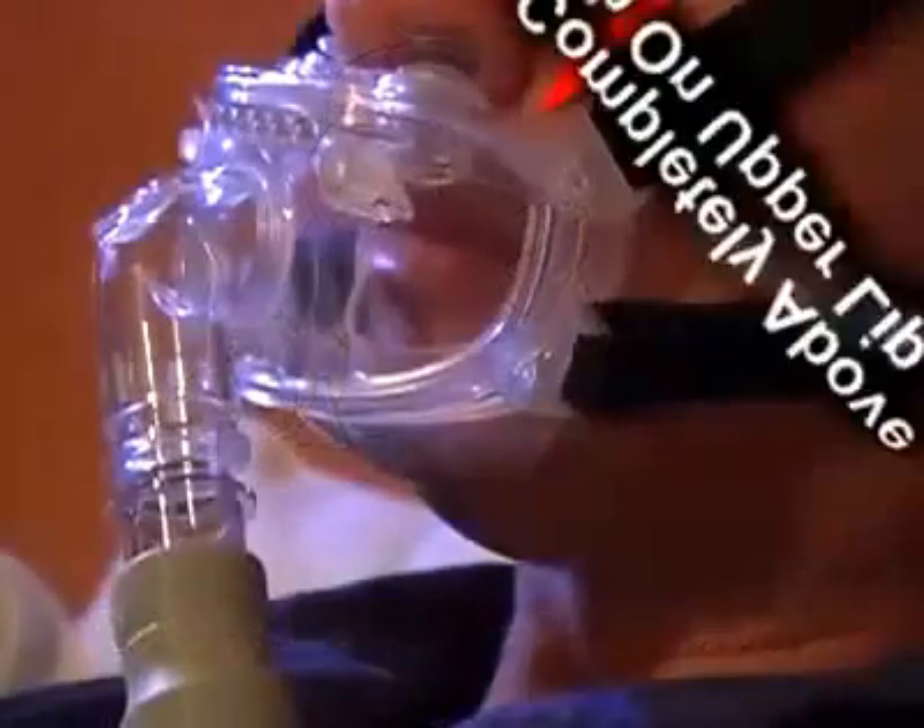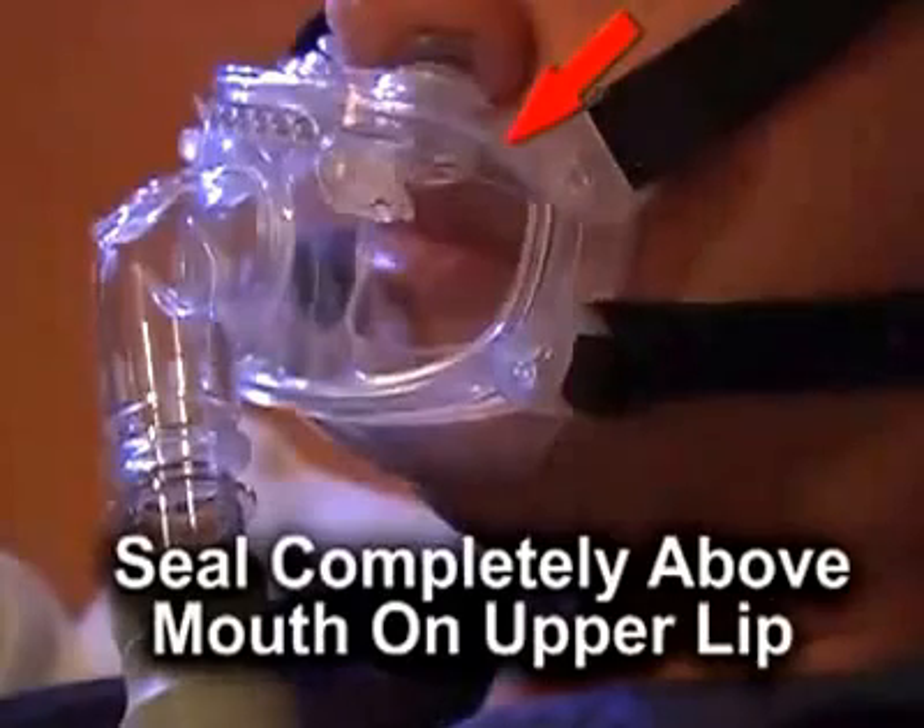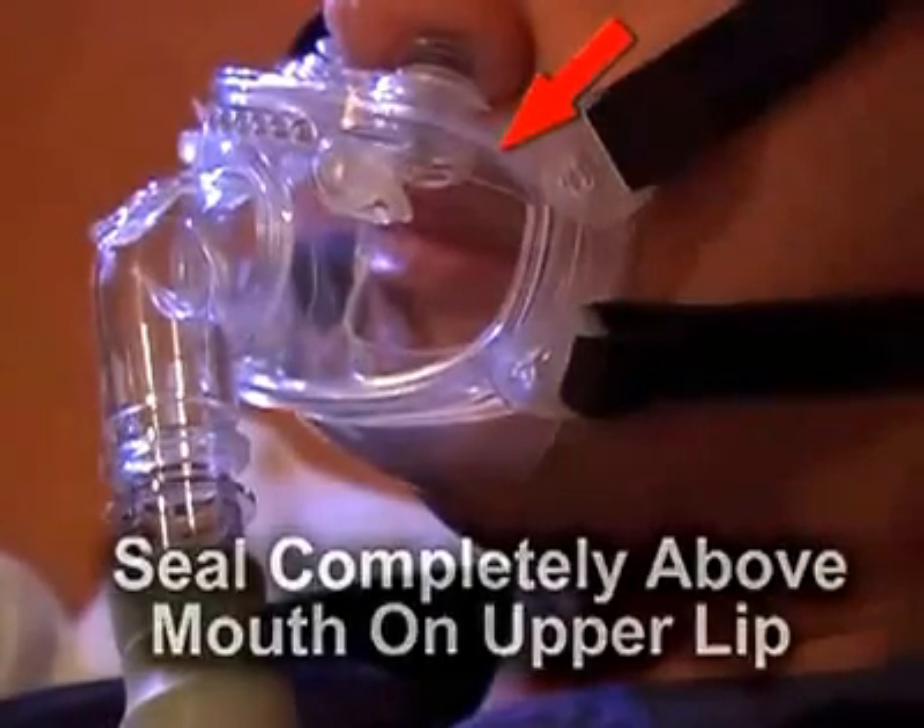Note that the upper wall and seal of the cushion should sit completely above the mouth on the upper lip. Adjust the headgear's four side straps by gently pulling the Velcro tabs until the interface cushion fits comfortably on the face. Note that each strap should be adjusted to achieve an overall even and balanced pressure between the cushion and the face.